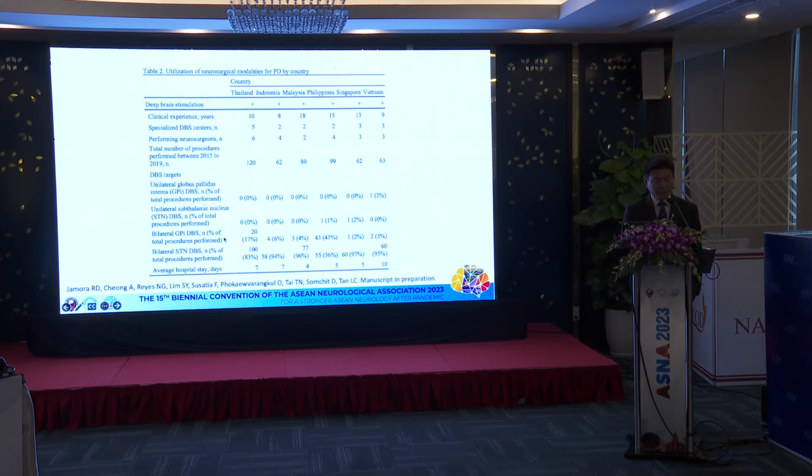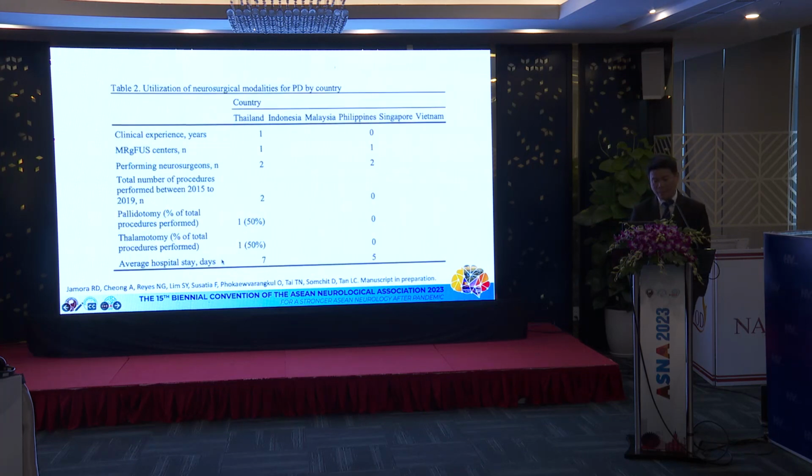It's usually bilateral STN, unilateral STN for one patient in the Philippines because the patient had a pallidotomy in the US. And most would be bilateral STN DBS for Parkinson's disease.